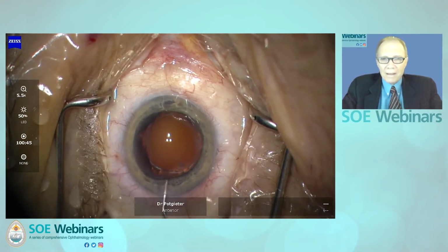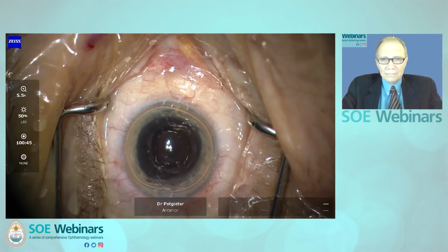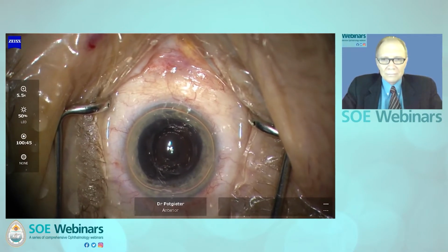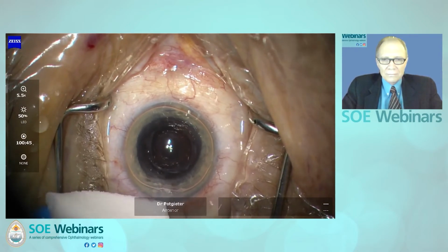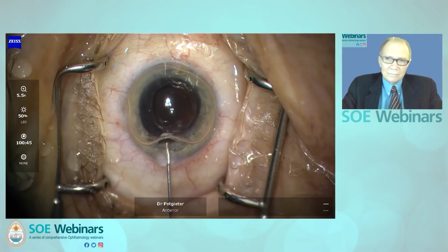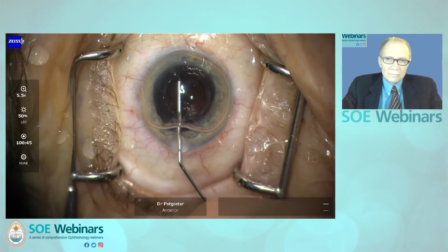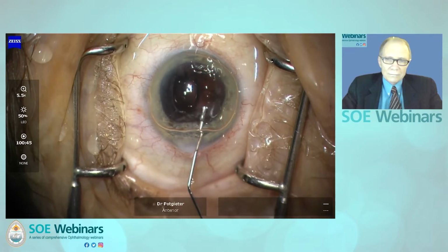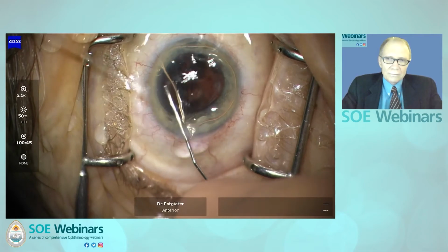The anterior chamber was then filled with air to confirm the absence of vitreous in the corneal incisions as well as in the anterior chamber. The air was also utilized to push the remaining vitreous posterior to the capsular scaffold. This was then followed by sealing the main incision with high molecular weight cohesive viscoelastic, after which the anterior chamber was filled completely with the same material. Care was taken to trap the vitreous in the posterior segment.